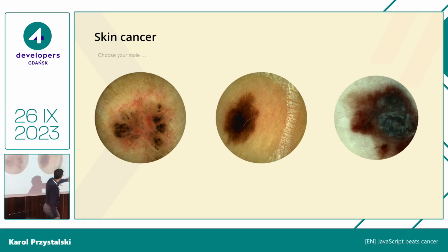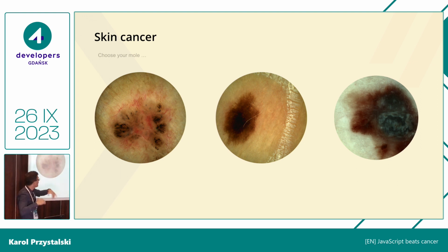Let me show you. Do you see a kind of blue-gray color here? I mean, okay, the lighting isn't perfect, but there is an area of blue-gray. This is a pattern saying this mole is already deep inside the skin. It has already met the vessels. So this is a very advanced skin cancer. Bad for the patient, but yeah, that's how it looked.